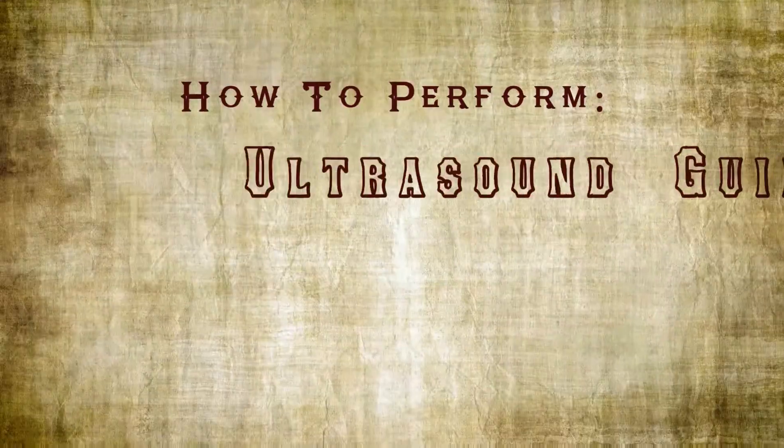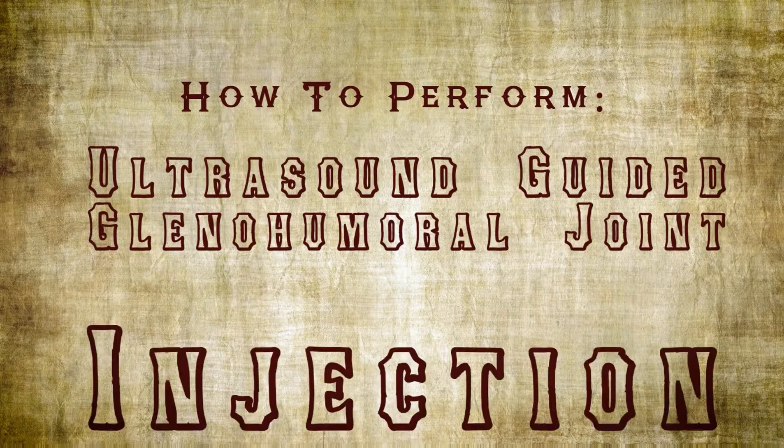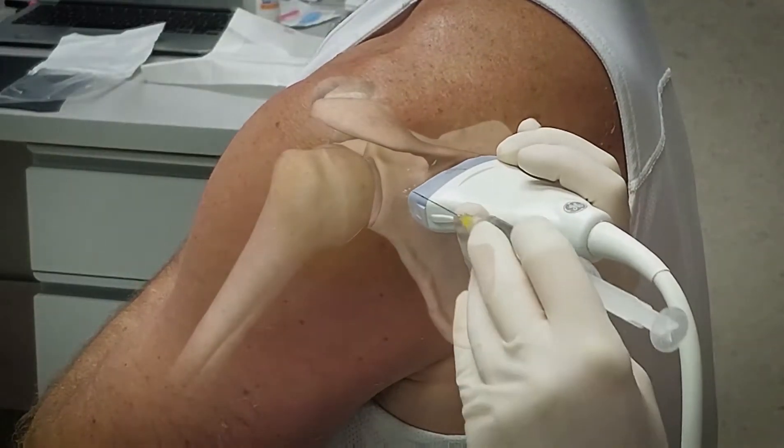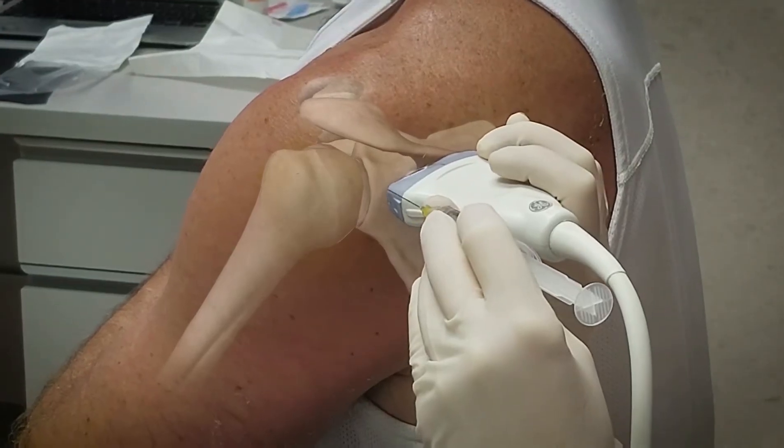Hi, I'm Tricia Feeney. And I'm Brian Hodge. Welcome to this educational video about how to perform an ultrasound-guided glenohumeral joint injection. The purpose of this procedure is to offer a patient relief from shoulder pain by introducing a local anesthetic and a steroid directly into the glenohumeral joint.